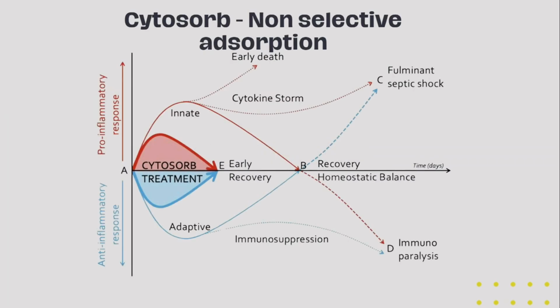Cytosorb, we are familiar with it. And this is my favorite slide. If I have to explain this slide, it will take at least a day. All that I will tell you: A is your patient. You are giving a standard line of treatment to him, and you hope the patient at A will reach B, which is recovery. All right.